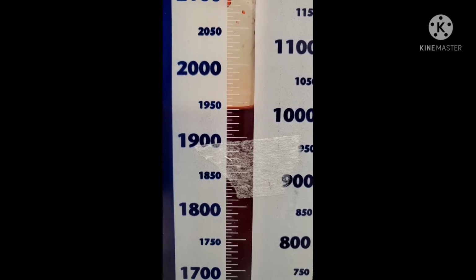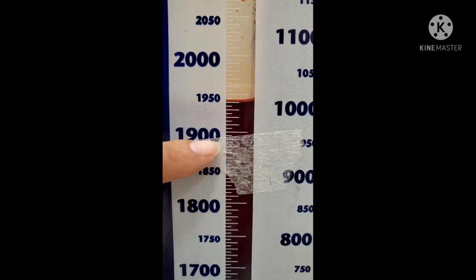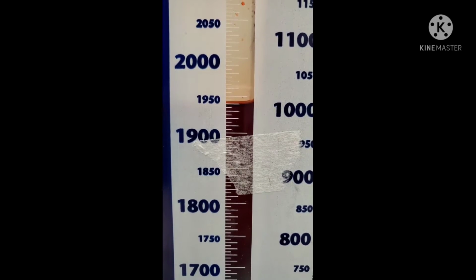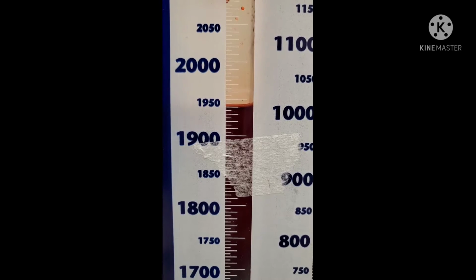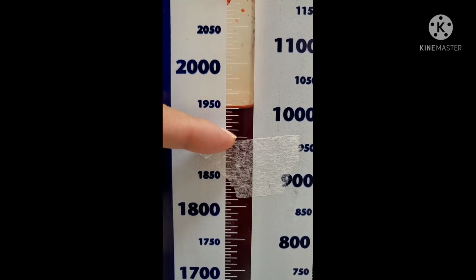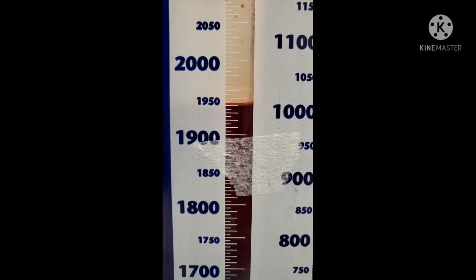However, the nurse before me left this little indicator here, and she finished off at about, say, 1900 for the sake of making it simple math. So if she finished at 1900 and I have 1945, I have 45 cc's of drainage during my shift.